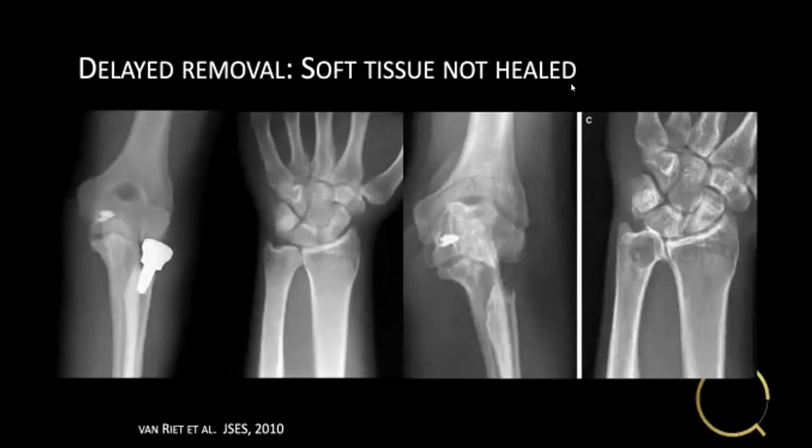This is, again, not my patient, but Dr. Maury's patient, where the radial head had been in for 4 years. It was removed for pain. It looked perfect pre-op. During the surgery, Dr. Maury assured me that he was pulling it, he was trying to dislocate it. It was very stable, both longitudinally and varus valgus, but unfortunately, although it was stable during surgery, he did develop valgus instability and longitudinal instability, and this ended up in a total elbow replacement. So this is something to be avoided if we can, and this is the reason why I prefer, and we'll talk about this in a second, to replace the radial head instead of remove the radial head component.